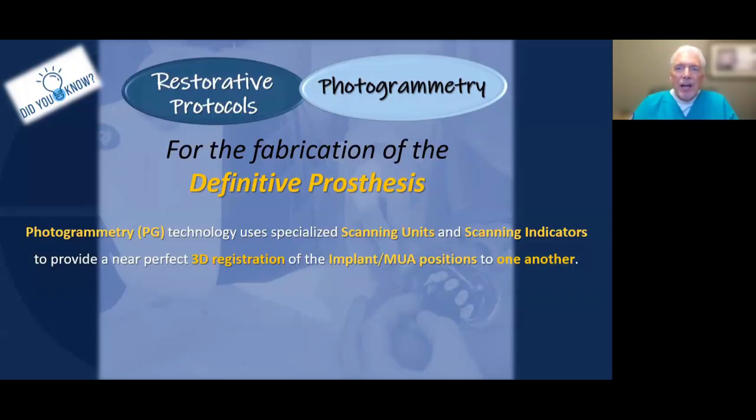I just want to share with you, if you're working with another clinician who has photogrammetry, where they can utilize this and what the benefit of that technology would be.